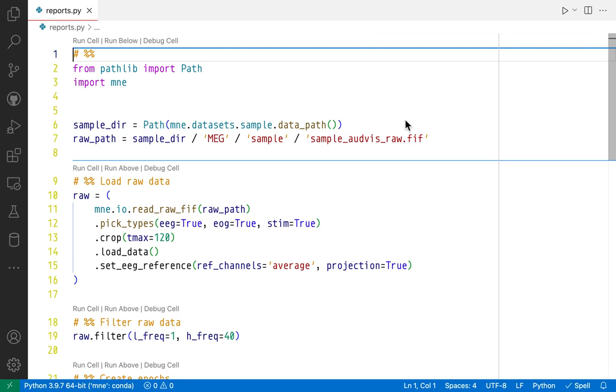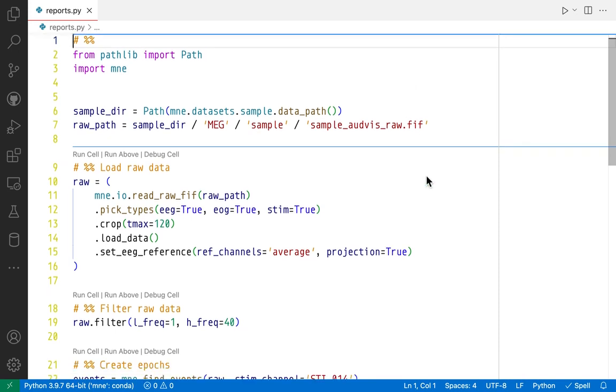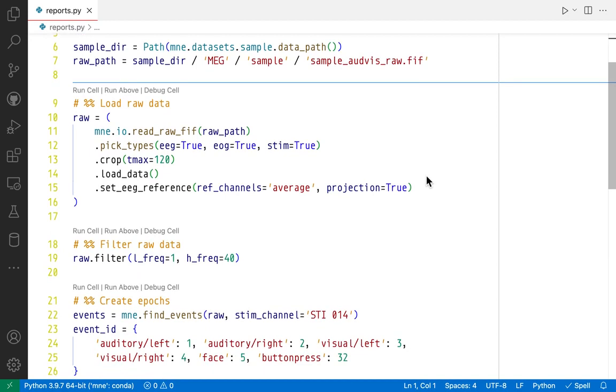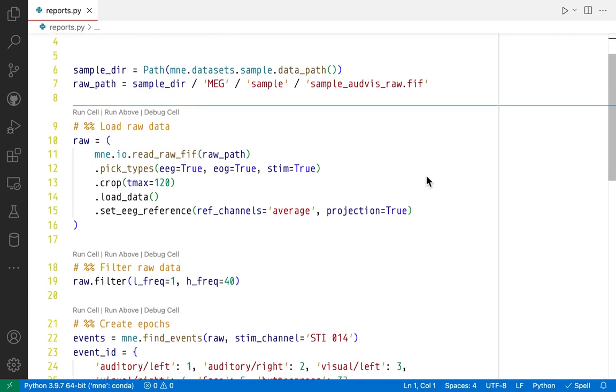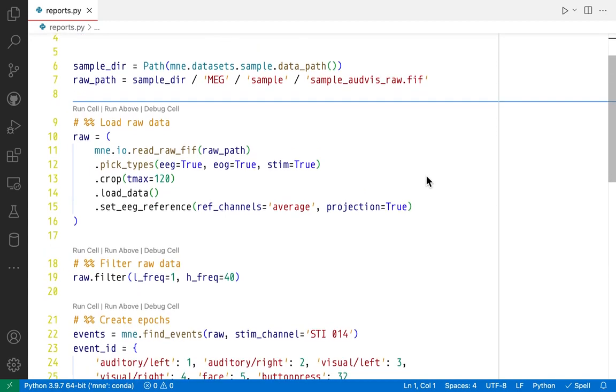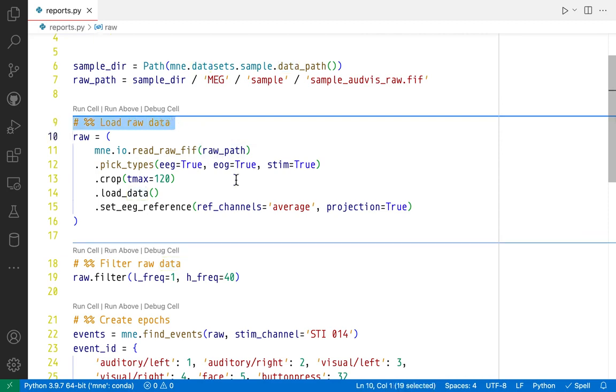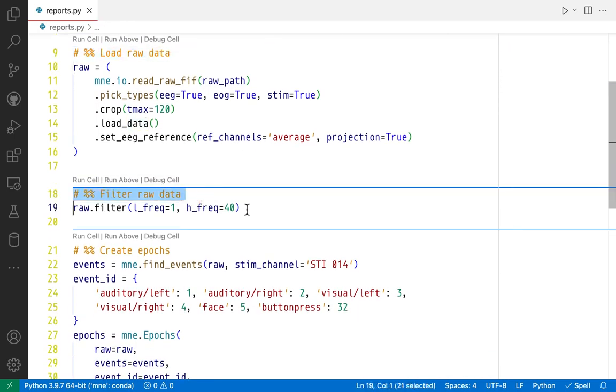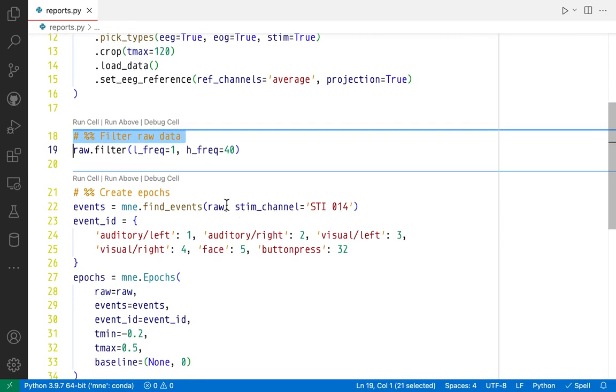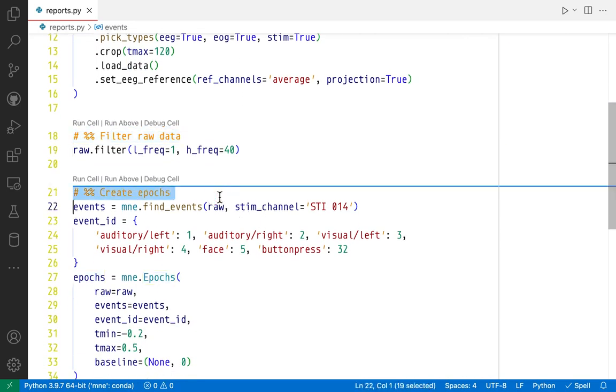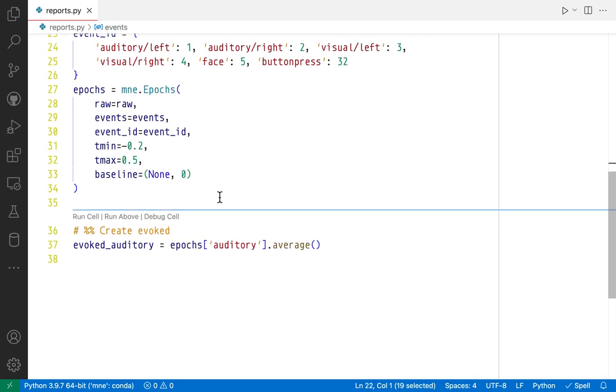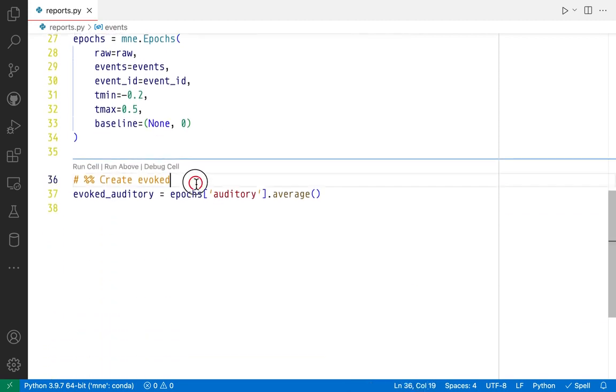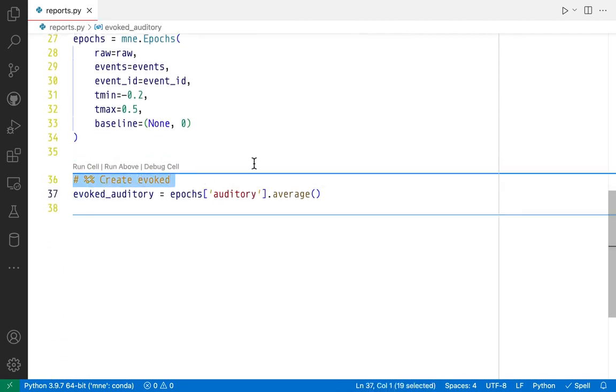I've prepared here a very simple script that performs some crude processing on the MNE sample dataset. It first loads the raw data, then filters it, creates epochs, and lastly creates an evoked object based on the epochs.